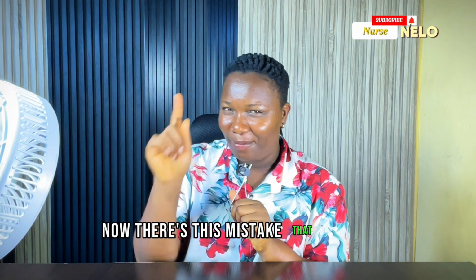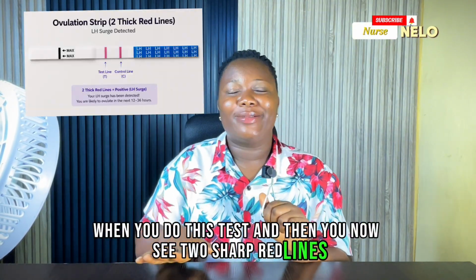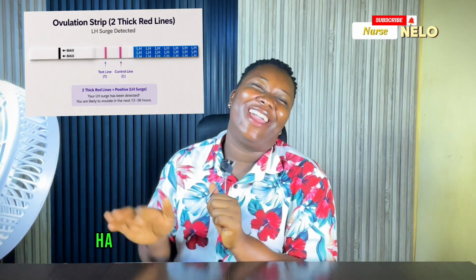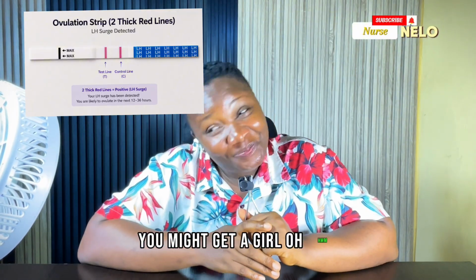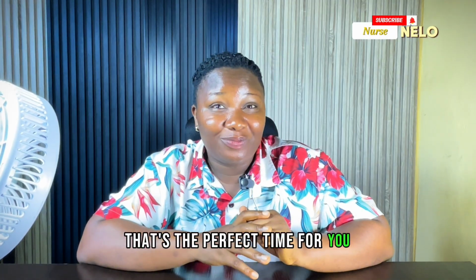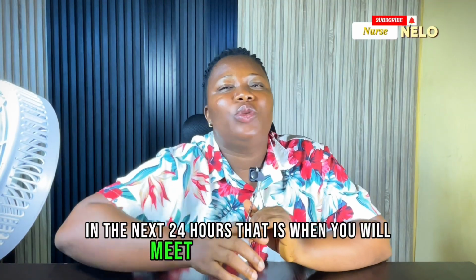Now, there's this mistake that women make. When you do this test and then you now see two sharp red lines, some people will say, it's time. You now gotta meet with your partner. If you are looking for a boy, you might get a girl. But if you are looking for a girl, that's the perfect time for you. But if you want to conceive a male baby, once you see two sharp red lines to show that your ovulation is coming, in the next 24 hours, that is when you will meet with your partner.